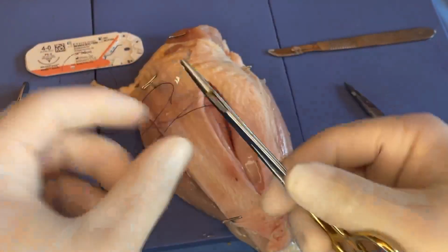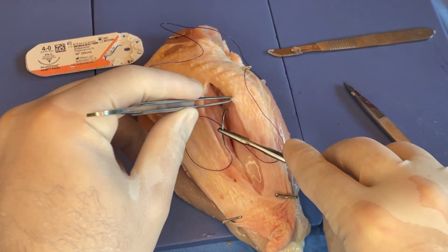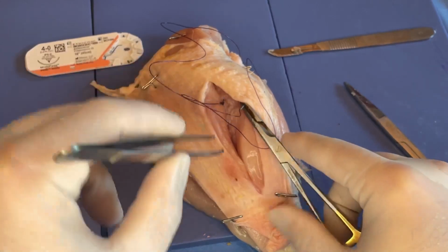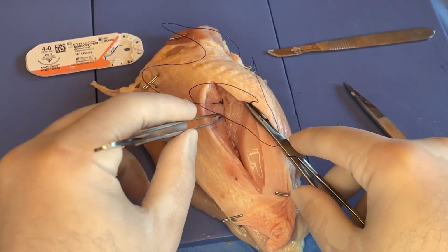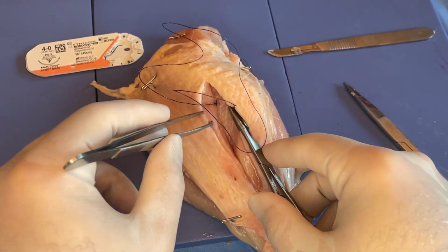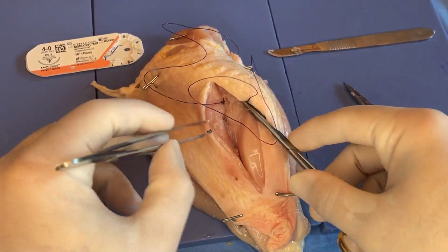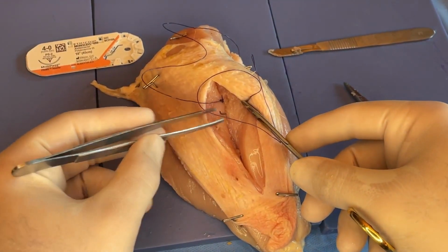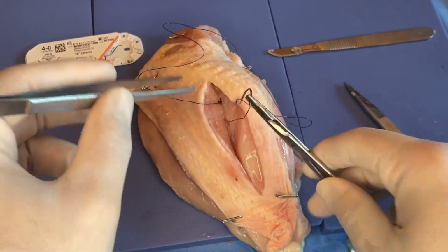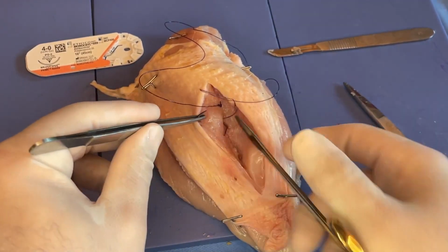strand, so we can do this as just kind of a quick little running. So using the forceps to kind of evert that edge a little bit, kind of pull that out of the way so I can do my pass. So you can see that I've almost used the entire needle length just to do my first bite, so I'm really not going to be able to come across probably and do both sides in one bite. So I'll just come out in the middle, reload down here at the tissue, take my second bite through here.